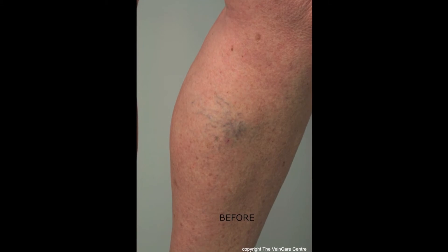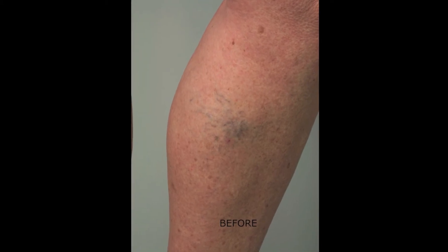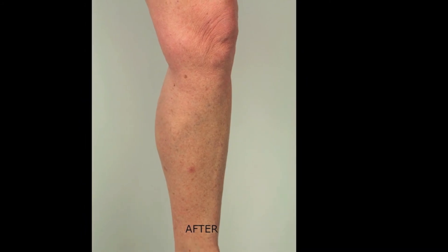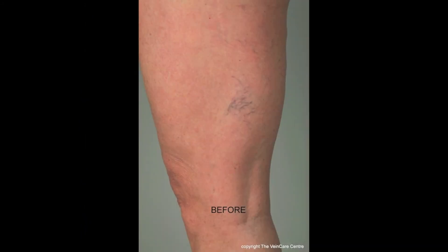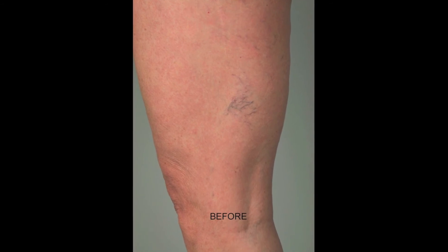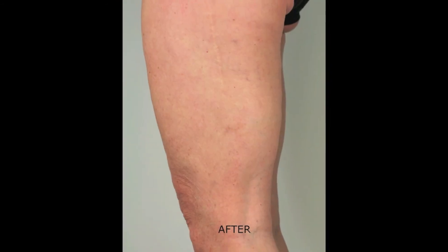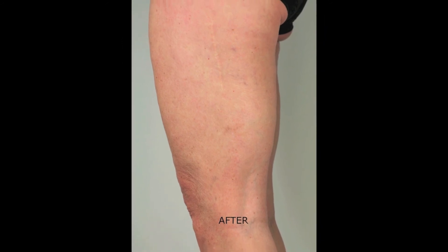Microsclerotherapy is the treatment of choice, though many injection sessions may be required — typically up to three — with an interval of six to twelve weeks. Microsclerotherapy remains the gold standard for leg vein telangiectasia.